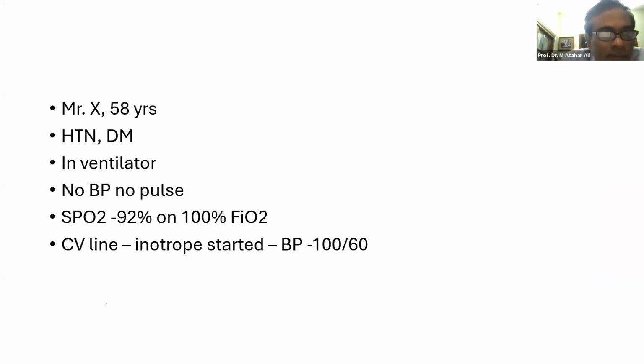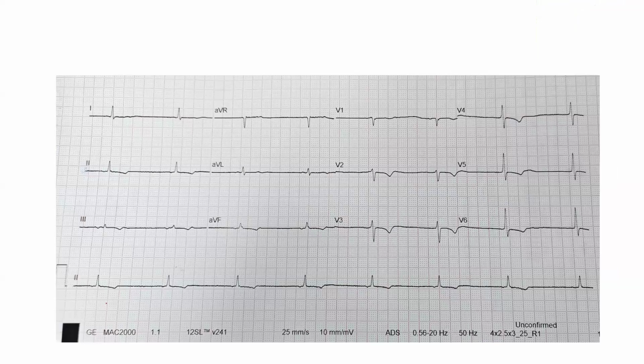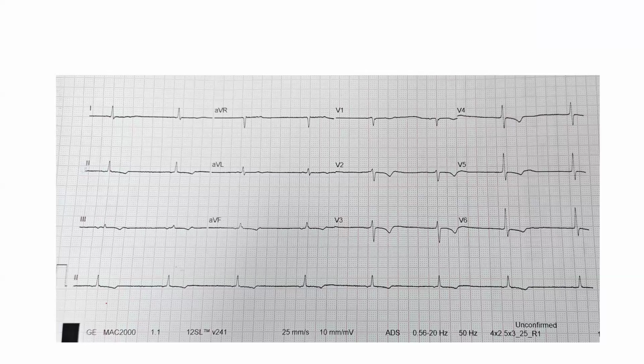Jamil? Yeah. The ectopic rhythm is from the atrium, near the atrial. That is the escape rhythm, the escape rhythm from the atrium. And another thing, sir, is whether the R wave is slurred. V3 not much, a bit slurred.